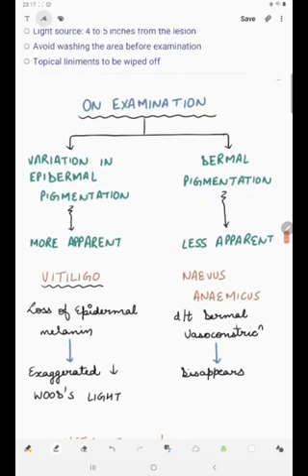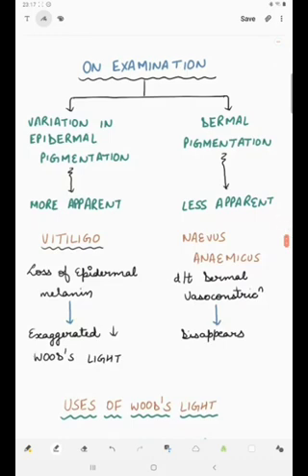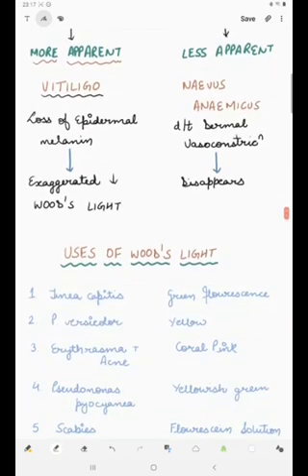On examination, Wood's lamp will respond differently to epidermal pigmentation and dermal pigmentation. If there is any variation in the epidermal pigmentation, it will become more apparent. For example, vitiligo. In vitiligo, there is loss of epidermal melanin. When vitiligo is examined under Wood's light, it will be exaggerated. The lesion of vitiligo will be exaggerated.